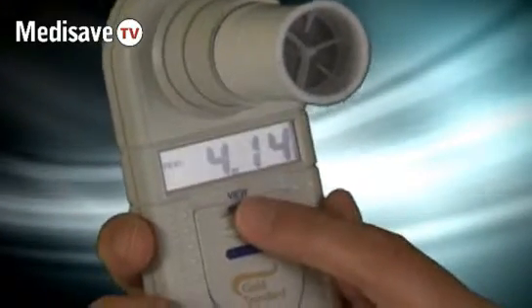Once you've written these down, to restart the test, switch it off, and then switch it back on, and you're ready to go.